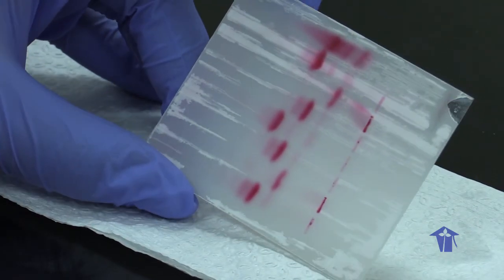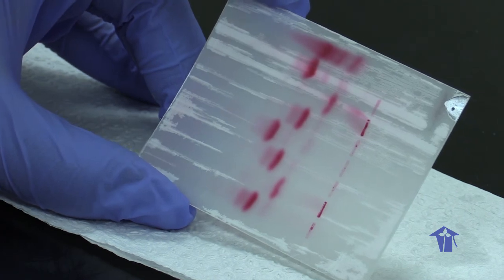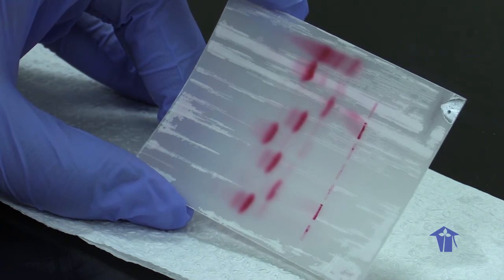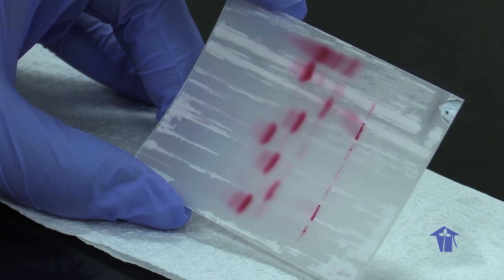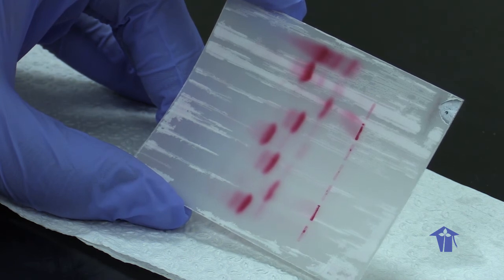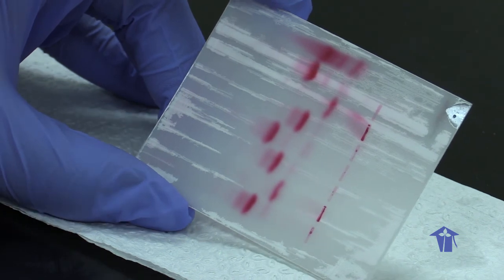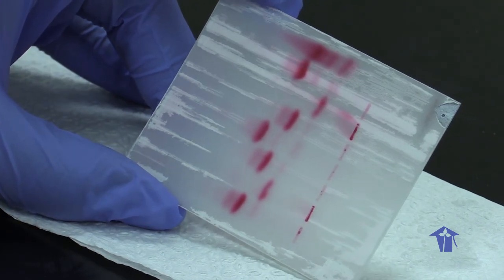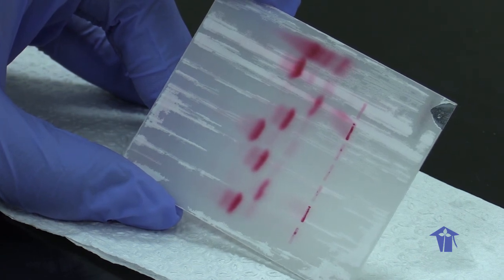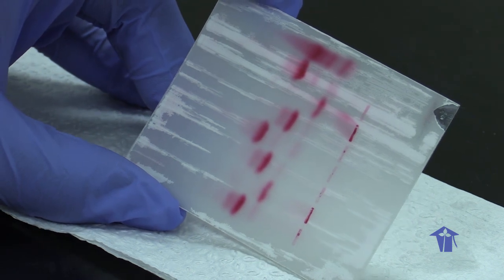One point is that to quantify, we cannot quantify the type of hemoglobin by just looking at the bands. We could say, well, one band looked a little heavier than the other, and therefore there may be more of that hemoglobin. But there's an instrument called a densitometer, which we can attach to the plate, and you can read the quantity, or you could determine the quantity of each of the different hemoglobin bands. But we don't have that here at the moment.